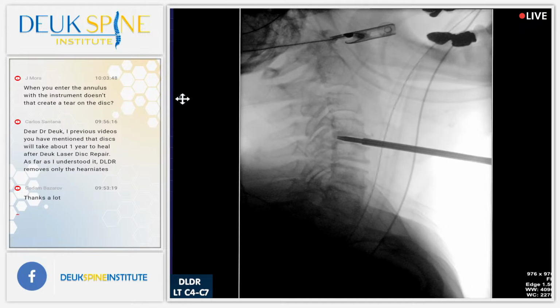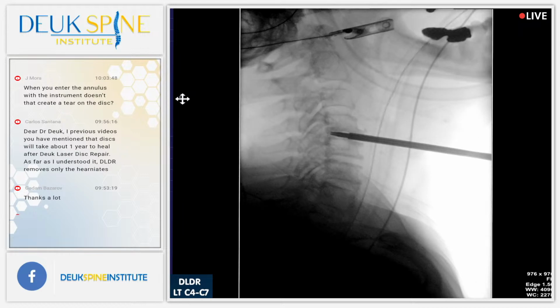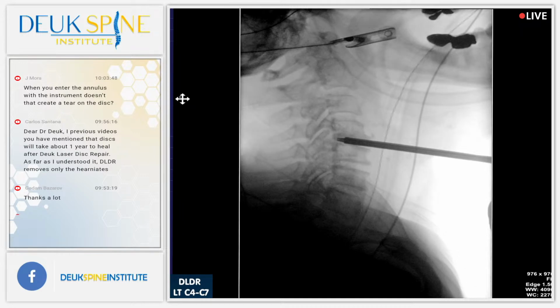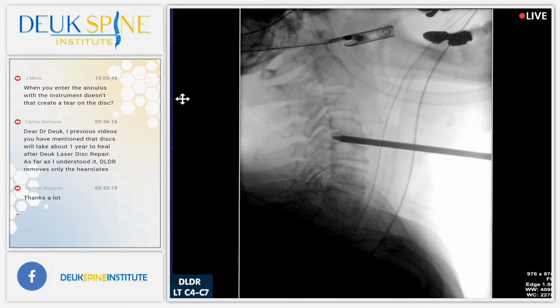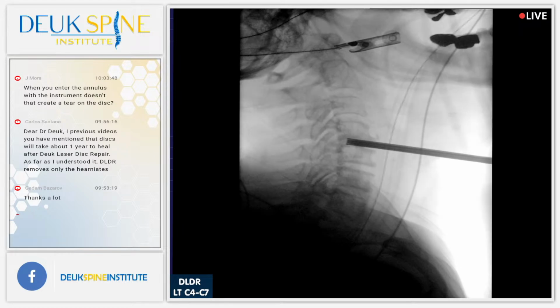Distract, distract, distract. Almost there. A lot of scar tissue. Hold on, just give me a second. Almost there. Shot. Man, a lot of degenerative disc here. A lot of scar tissue in the posterior annulus. I can feel it. That's probably the best I can do. Thank you, everybody. Good work. All right, let's get this last disc done, number 4-5.